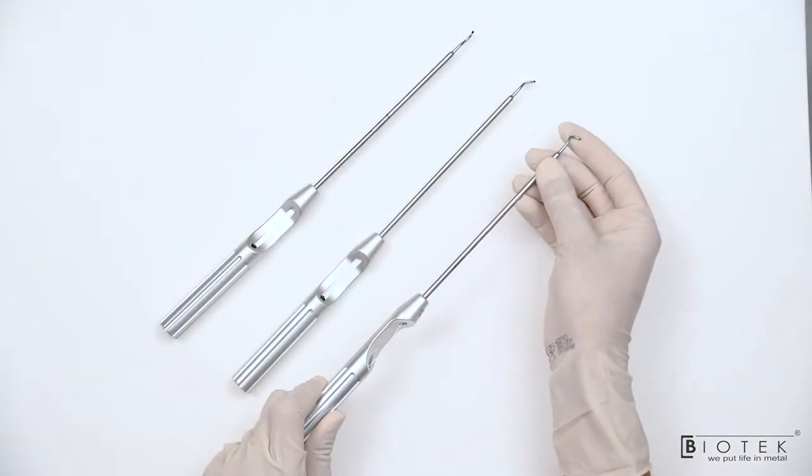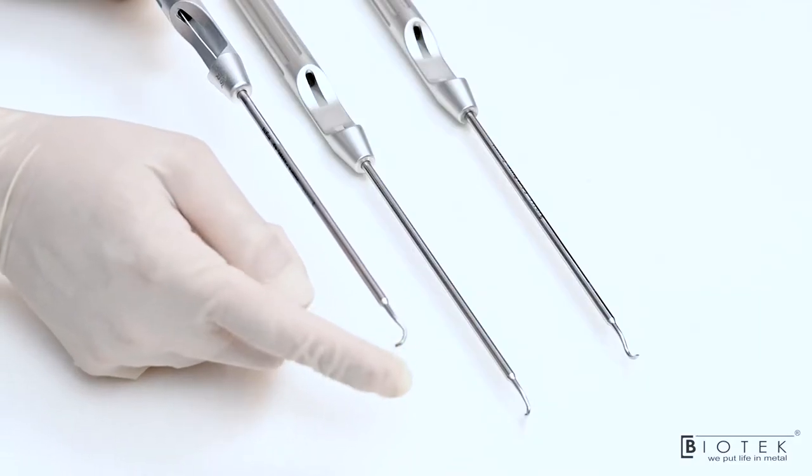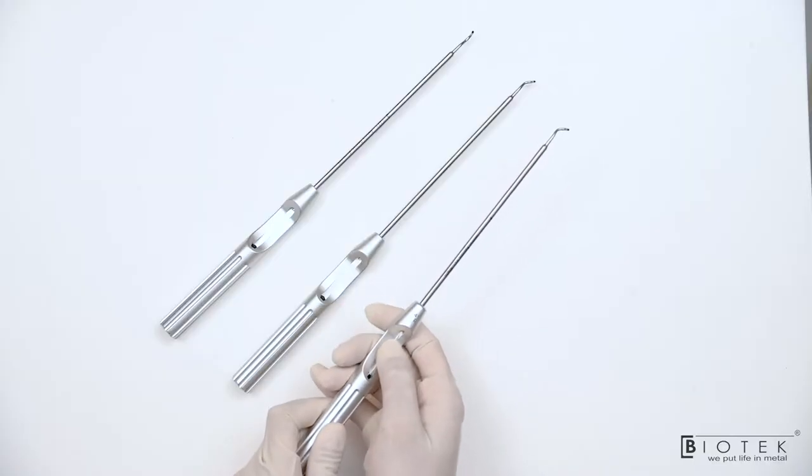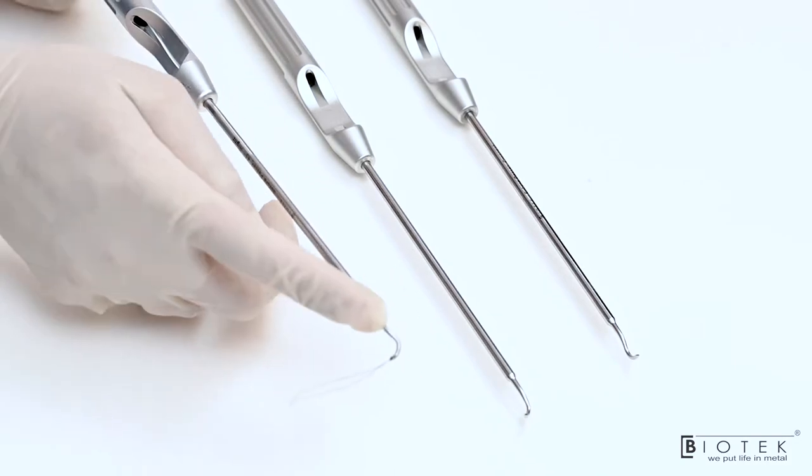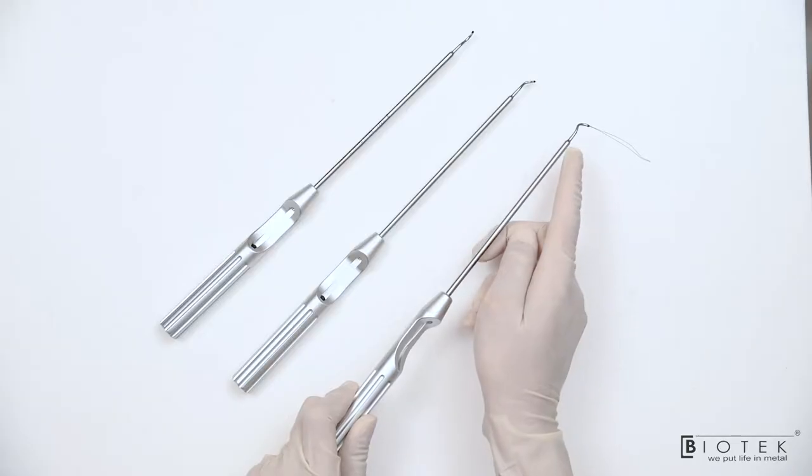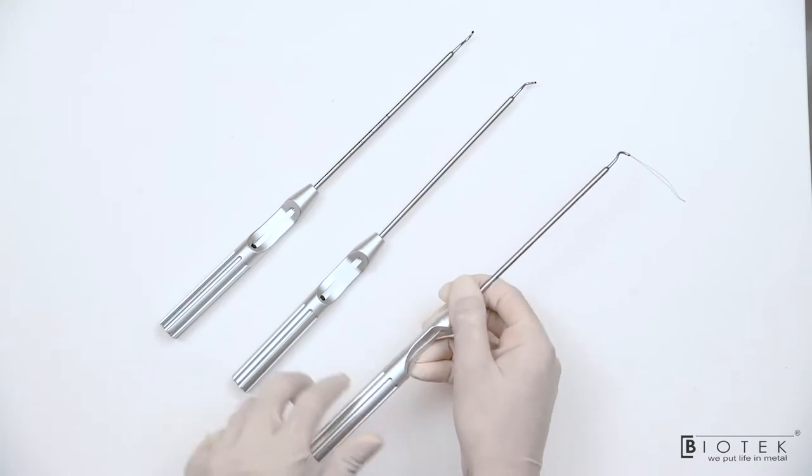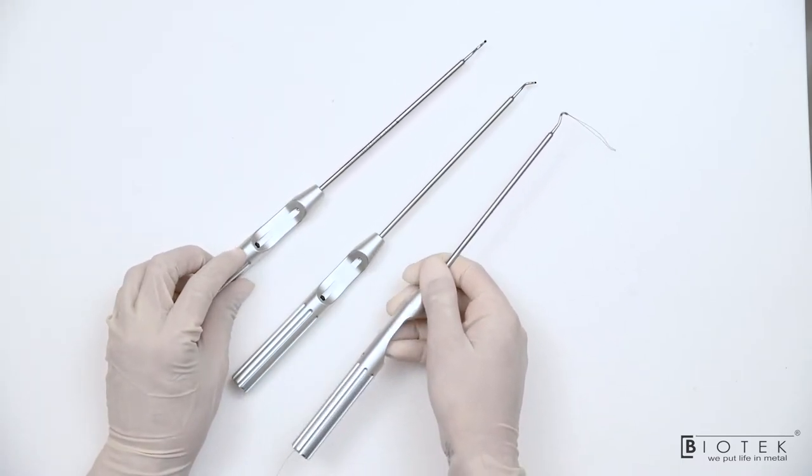This is reusable suture passer which has a sharp tip and a hollow cannula inside which passes a metal wire like this. It is 45 degree right. Similarly there is 45 degree left and straight curved suture passing wires.